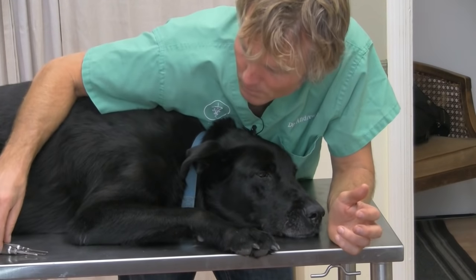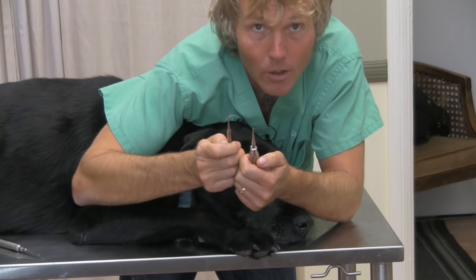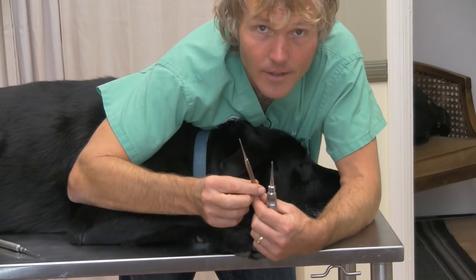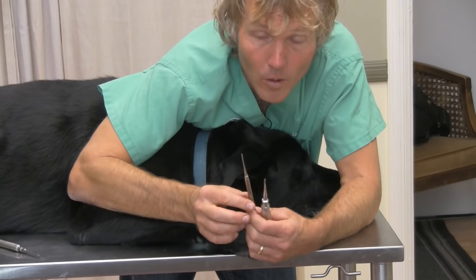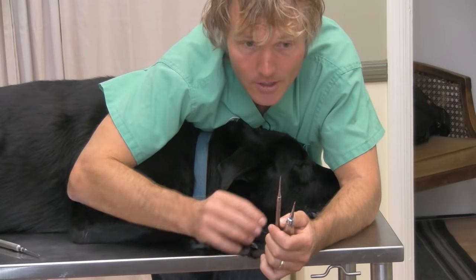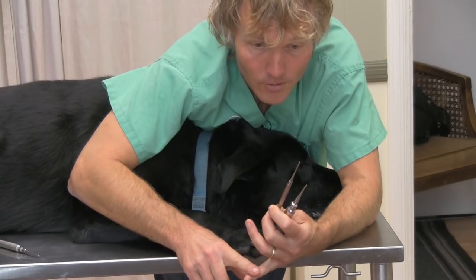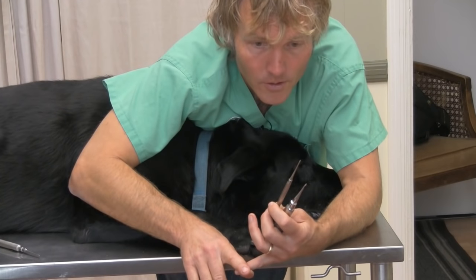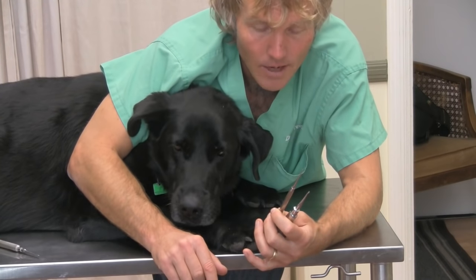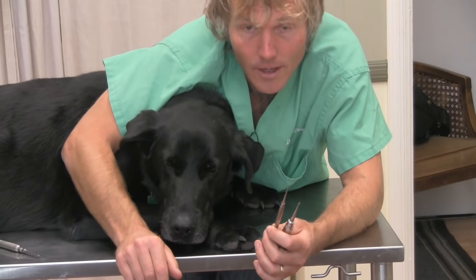In this section of the video I'm going to show you a couple of different dental instruments. These are hand scalers, similar to what your own dentist would use. This is what we would use in veterinary practice as part of scaling — a combination of hand scaling with an ultrasonic scaler followed up with polishing. Ideally, if your dog has moderate to serious amounts of dental disease, you're going into see your veterinarian for a full dental scale and polish. But my experience is the majority of clients are not doing that, primarily because of cost, so they're just leaving those teeth getting completely covered in tartar. We're getting extensive periodontal disease leading to unnecessary pain and tooth extraction. So I think a real medium way around this is having you do some of this at home, especially if you can't afford a full-on dental.